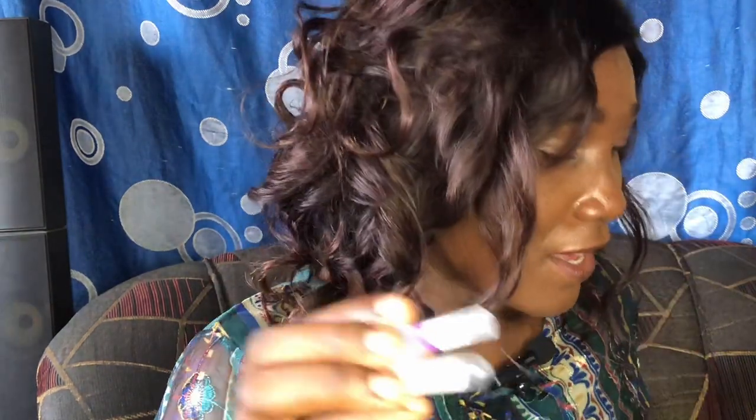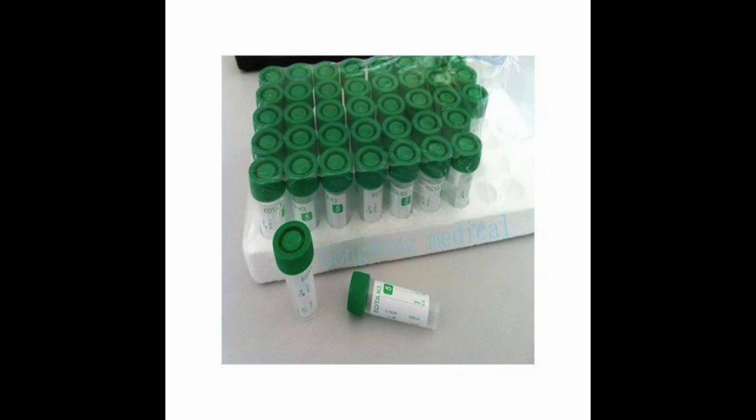So each time you come for your PCV, your MP, your routine test, your full blood count, you can go ahead with this tube. This is the fifth order of draw. This also is an EDTA, so it's used for the same purpose in the hematology lab.